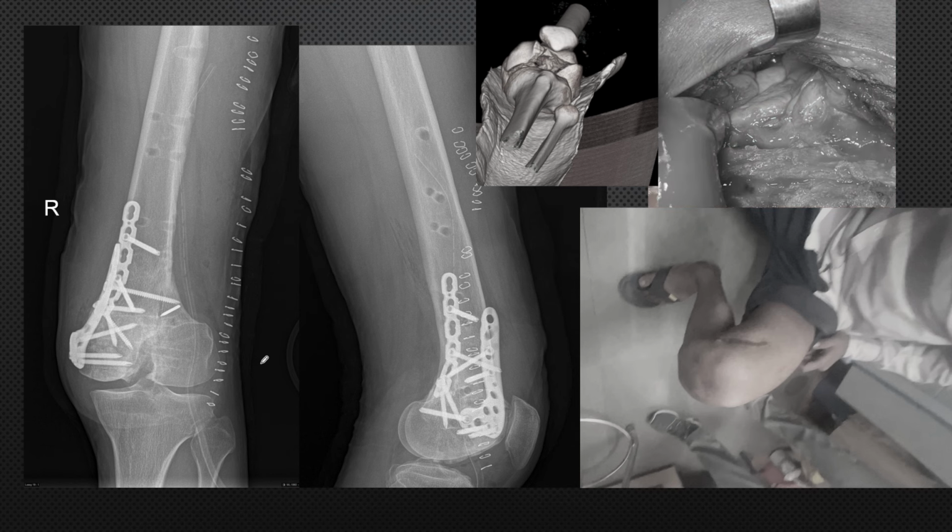So we performed the implant removal at 1 year follow-up, and the patient was asking whether the medial side plates can also be removed. But you see here, when we remove everything, we are probably creating a lot of voids, so that can result in a stress riser and a fracture. So we counseled the patient for removal of lateral side implants only. So we removed the posterolateral plate and the lateral plate, and this was the post-operative radiograph after implant removal.